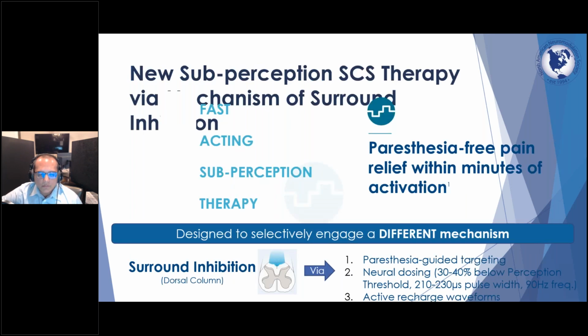So the new subperception spinal cord stimulators theory is paresthesia-free pain relief within minutes of activation. And as a side note, the reason this is clinically relevant, and understanding the mechanism of action matters, is because of how quickly it actually sets up.